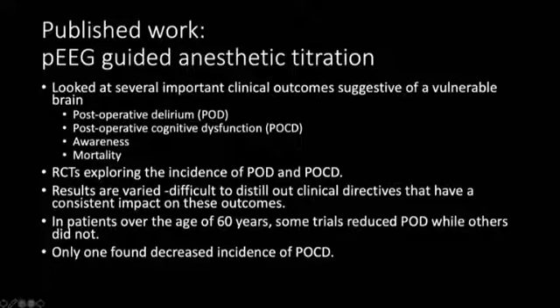For example, in patients over the age of 60, some trials found that using EEG-guided anesthesia reduced postoperative delirium, while others did not. Only one study found a decrease in the incidence of postoperative cognitive dysfunction, while others didn't.